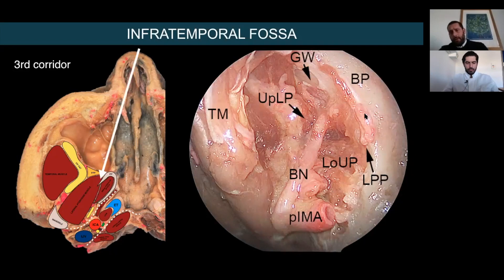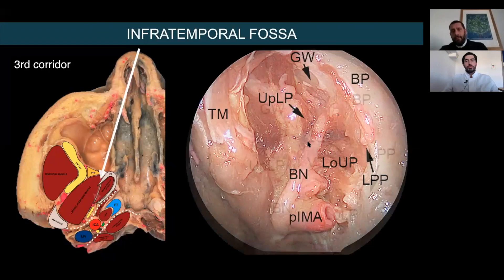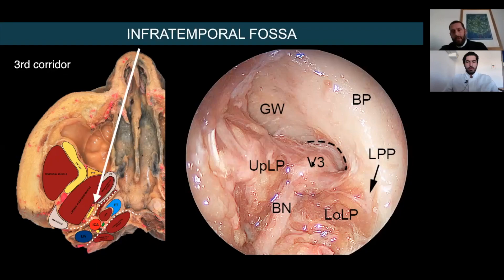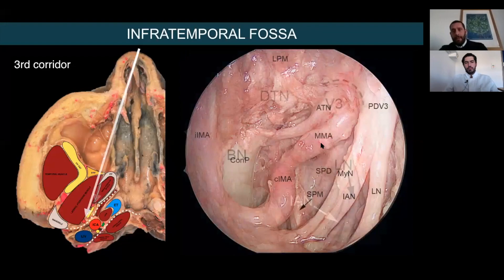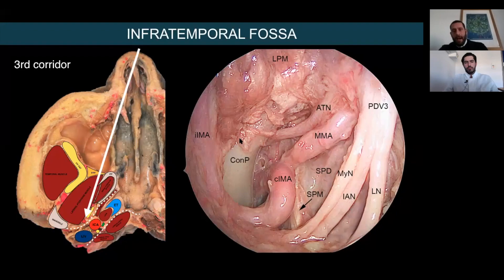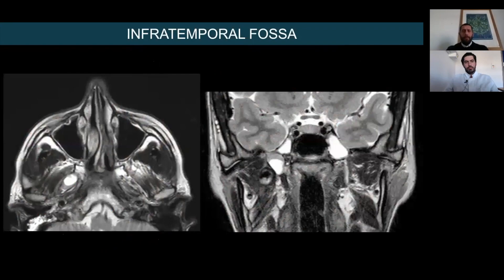A third corridor: the lateral pterygoid plate and the insertion of the lateral pterygoid muscle. If you dissect progressively in this direction, you start to see the anterior branches of V3 — this is the buccal nerve. Progressively dissecting, you identify the foramen ovale with V3. This is the lateral pterygoid muscle, the greater wing of the sphenoid, and the lateral pterygoid plate. You can see all structures of V3 and the posterior division with the lingual nerve, inferior alveolar nerve, and mylohyoid nerve. This is the middle meningeal artery, the auriculotemporal nerve going behind the condyle of the mandible, and the maxillary artery.